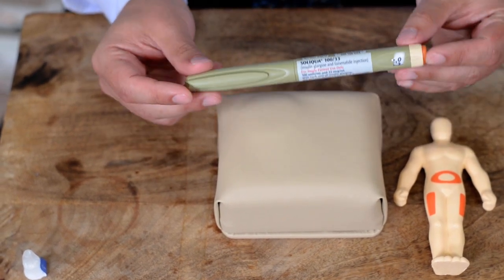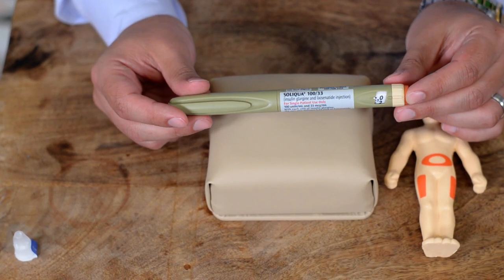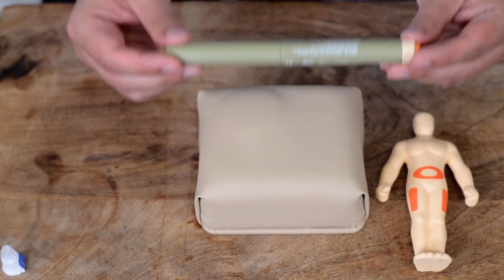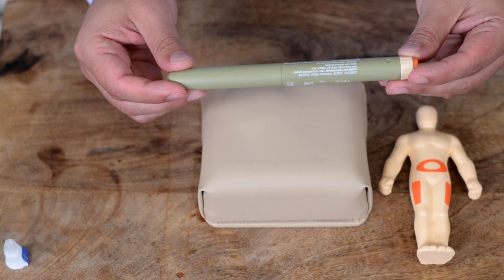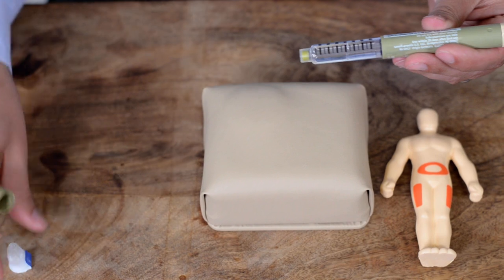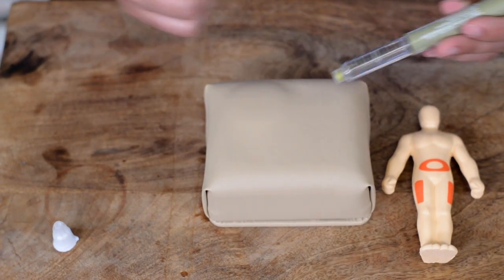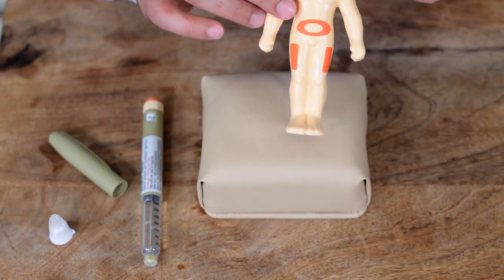You will get your dosing from your prescription and from your doctor, but practically this medication can stay in the refrigerator until the expiration date. Once you start using this pen, you can keep it at room temperature. Once you put the needle on it for the first time, you have 28 days to use it — whether refrigerated or not, you must use the pen within 28 days.